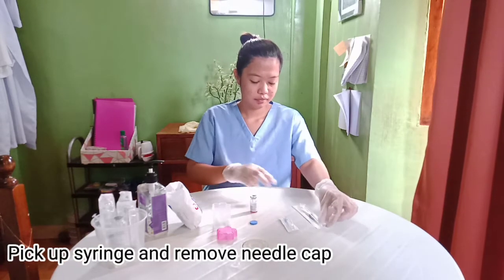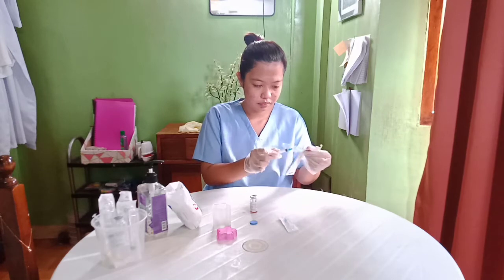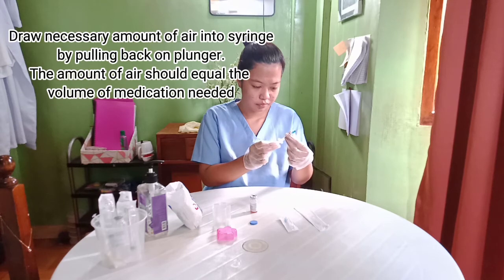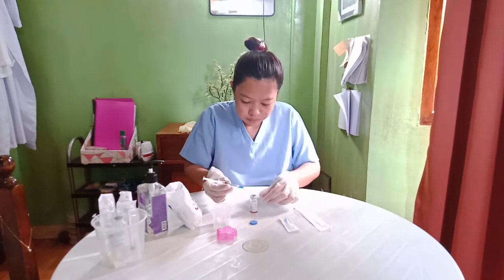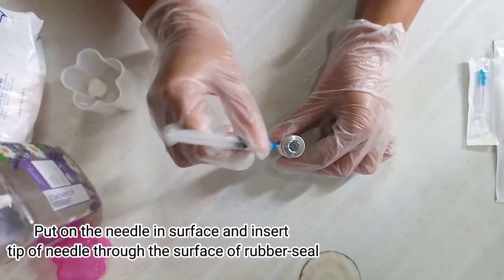Pick up the syringe and remove the needle cap. Draw the necessary amount of air into the syringe by pulling back on the plunger. The amount of air should equal the volume of medication needed.